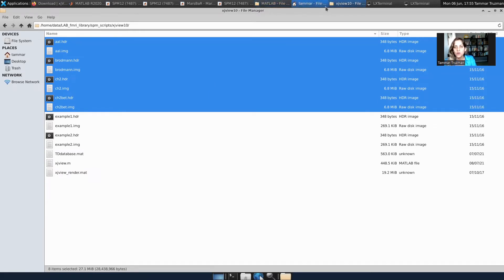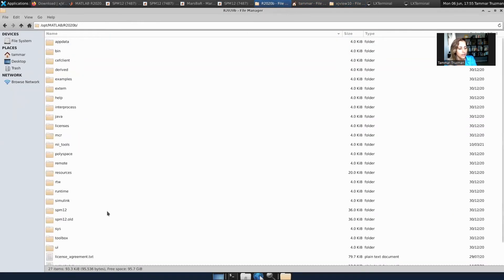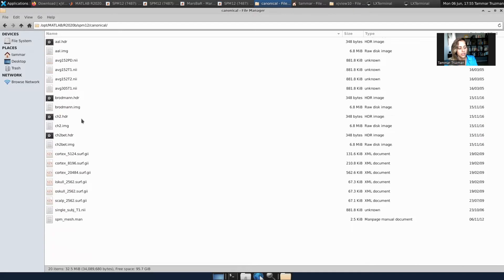So in my case, this is the MATLAB folder, and then under MATLAB you should find SPM 12 and then canonical. Believe me, you have it there. So I copied these files there.